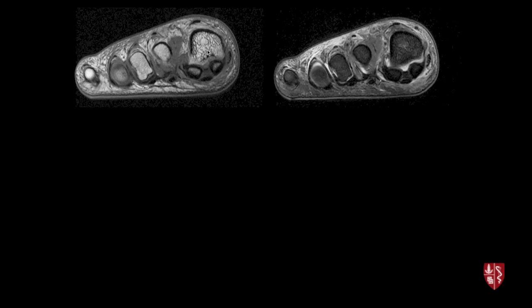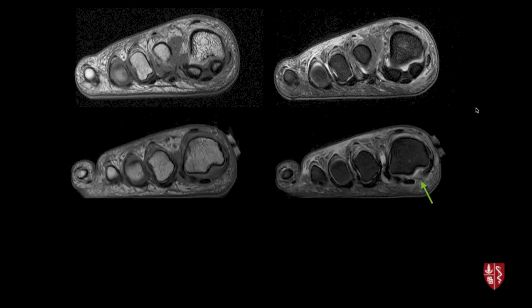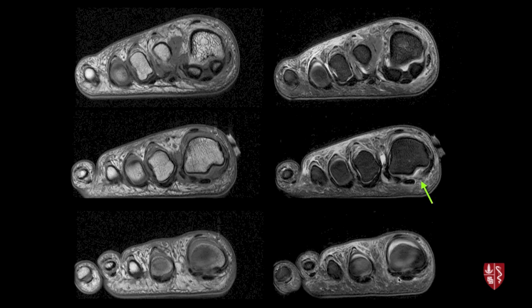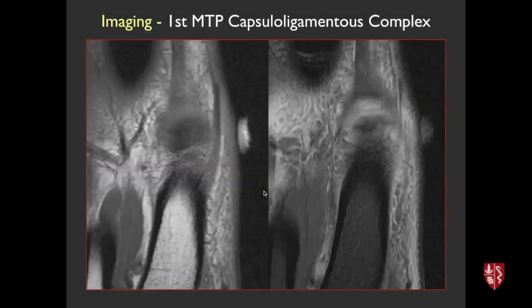Here's an abnormal example. More proximally the sesamoids and intersesamoid ligament look normal, but right here there's increased signal — partial tearing of a component of the plantar plate capsuloligamentous complex — while more distally things are actually okay. The practical approach is to follow structures from proximal to distal and medial to lateral; if you see partial interruption or interruption, that qualifies as a turf toe injury.